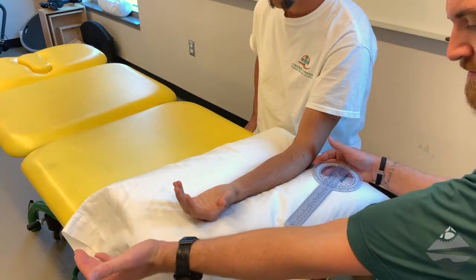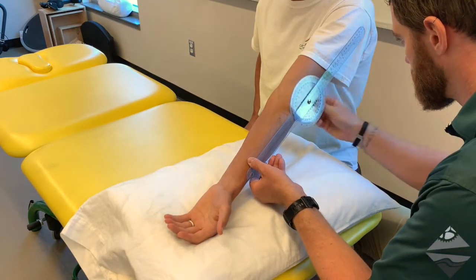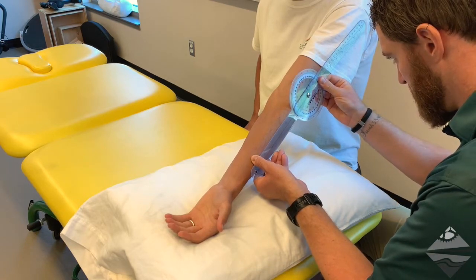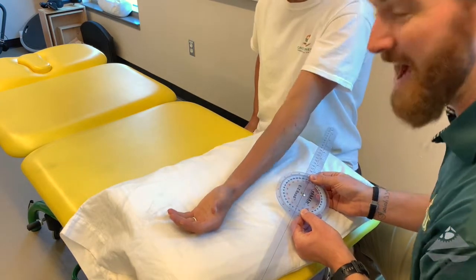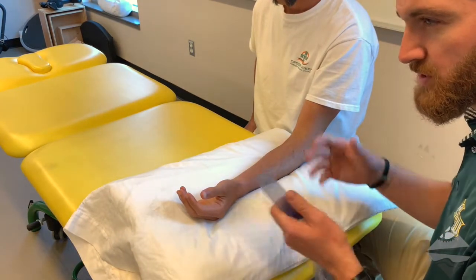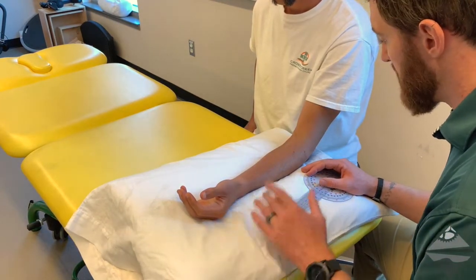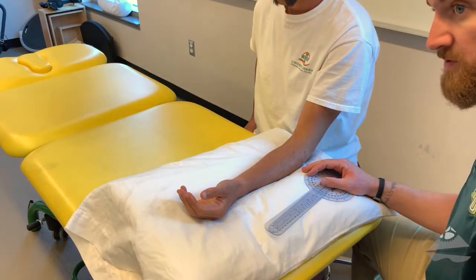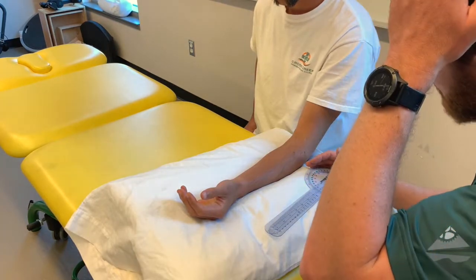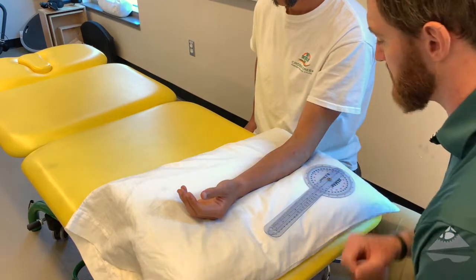Next we're going to look at elbow extension. All the landmarks are the exact same, and in this case we have about half a degree of elbow extension — that's close enough within our range of error to call that zero degrees, full elbow extension. It's not uncommon for someone to have slight hypermobility into extension; up to 10 degrees can be considered normal so long as that is a symmetric finding side to side.